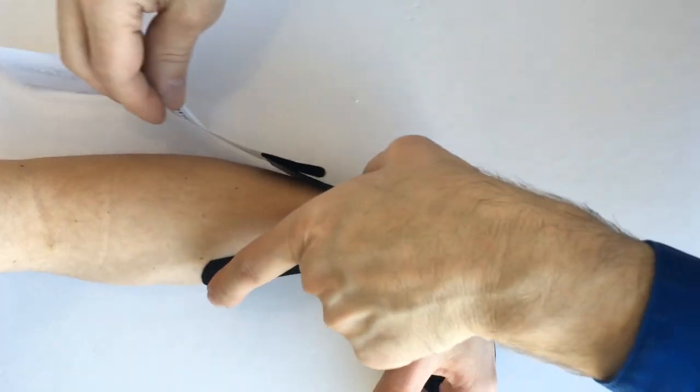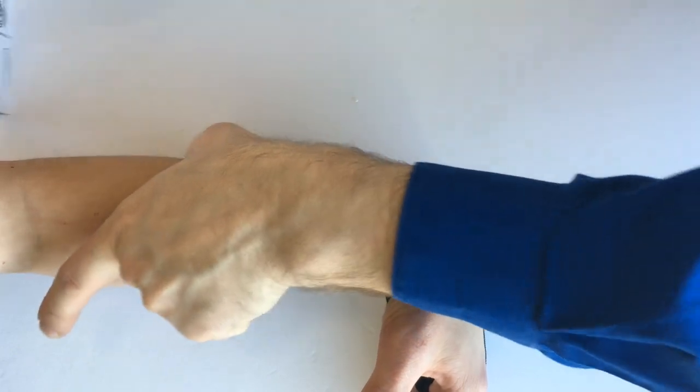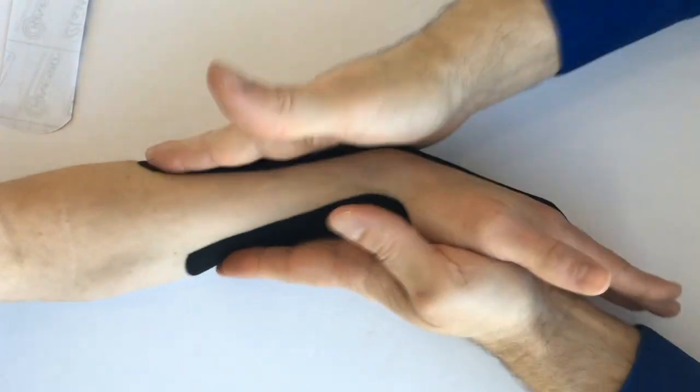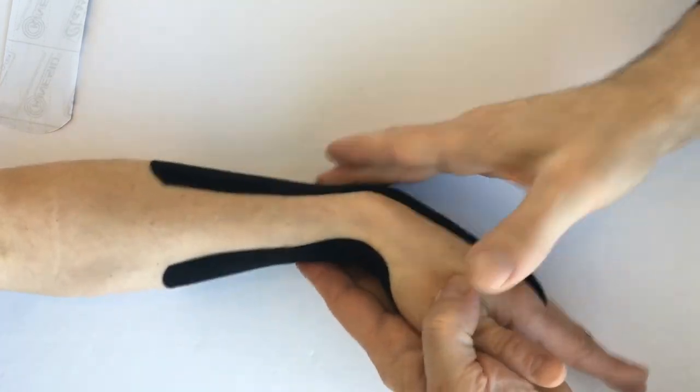Something like that, and rub it on there really well so that it adheres well.